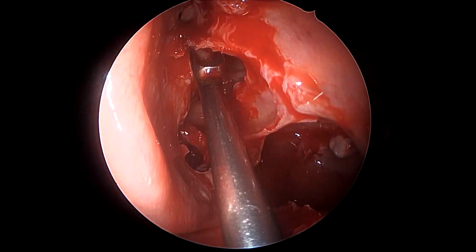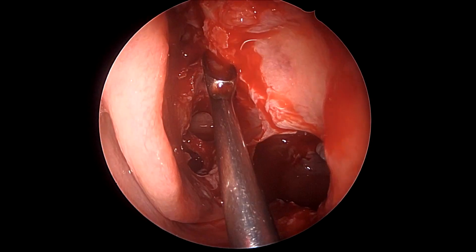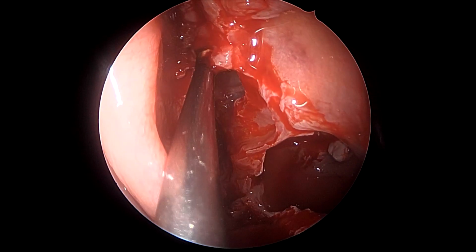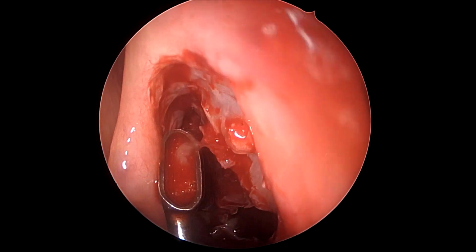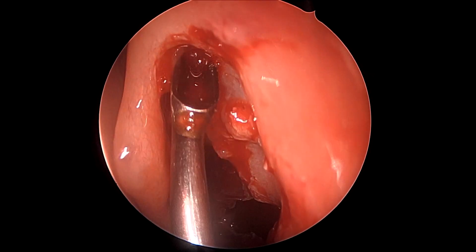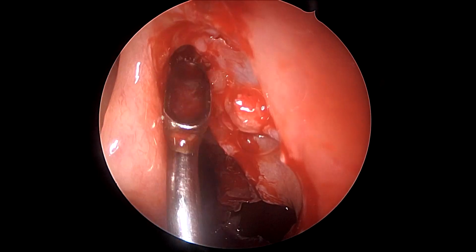We can see here how we can assess the depth of the ethmoidal septations using a curved elevator or a curved frontal sinus curette, and once done so, we can again fracture and open these septations so as to achieve gross clearance of the ethmoid complex and make it more amenable to clear, consistent nasal irrigation, especially using steroid-infused saline.